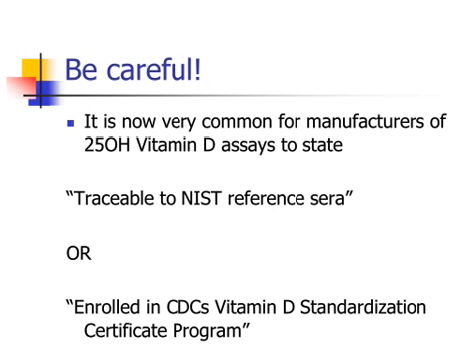Or they'll say things like they're enrolled in the CDC's vitamin D standardization program. But to be honest, my mother got enrolled in that standardization program. It doesn't mean she'll get a certificate. So unless you see the certificate or the bias data, then those statements, you shouldn't put too much faith into them.